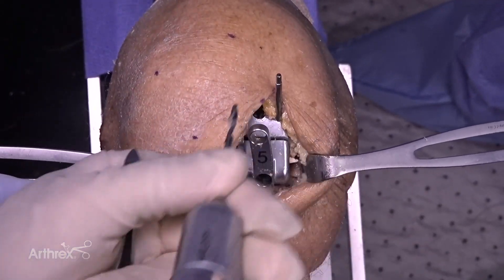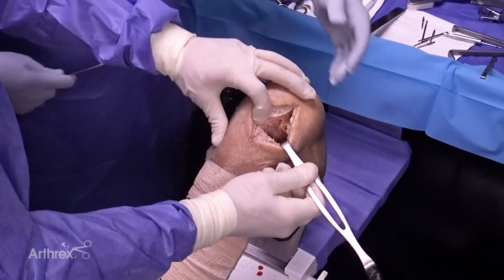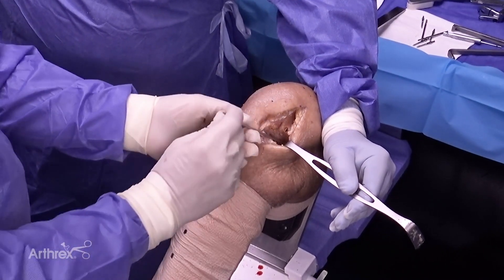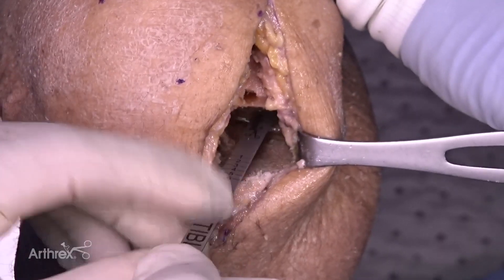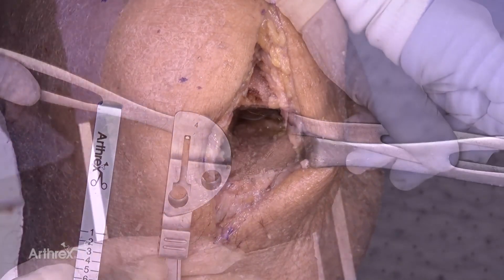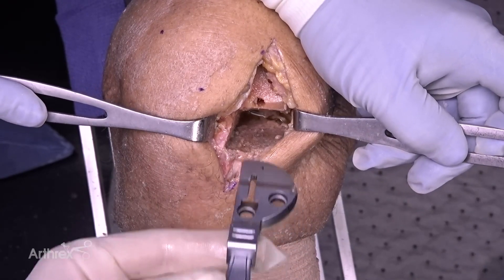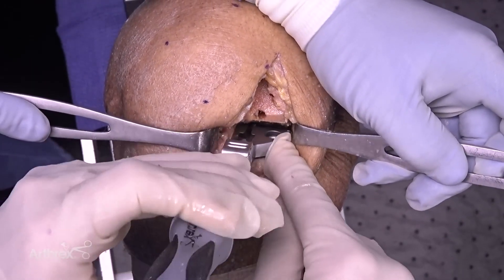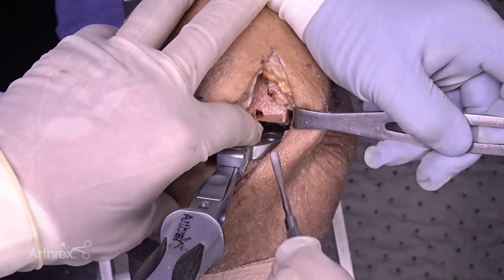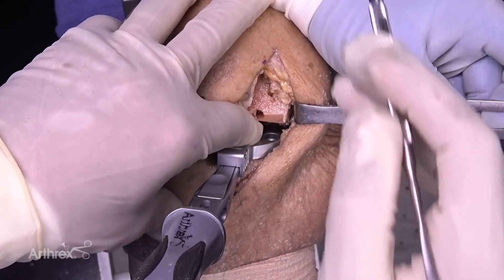Once femoral preparation is completed, we go on to the tibia. We look at sizing our tibial side — the ruler does the same thing on the tibia as it did on the femur. As I capture the back and pull out, it measured approximately a four — this is an anterior-posterior measurement. What's important is you don't want to overhang medially, which you can see visually quite easily. We select our tibial preparation guide to correspond to the measured size, in this case a four. I set it right up against the vertical wall so it's sitting on the anterior cortex. Two spikes sit down into the tibial bone. Using a freer elevator, I can feel and visually confirm we are absolutely flush with the cortex — this is a perfect size.